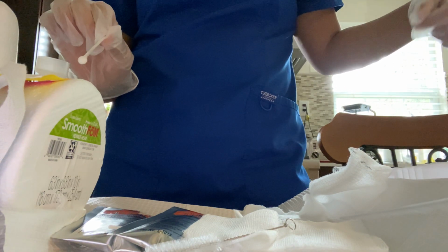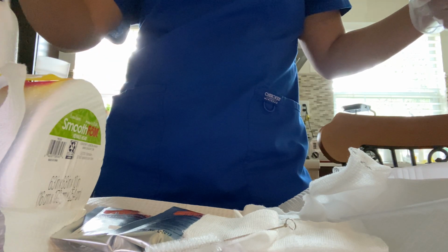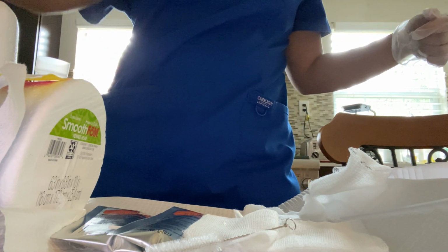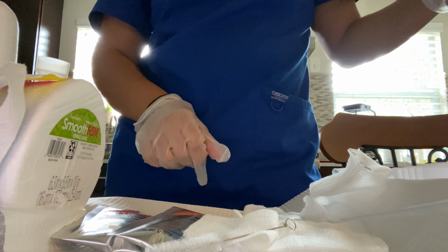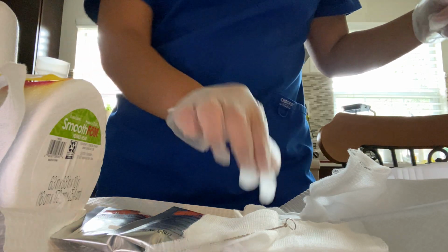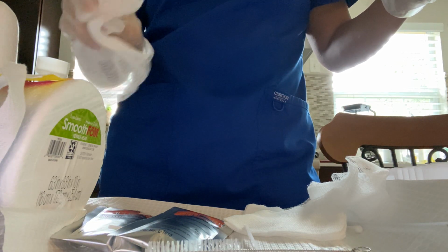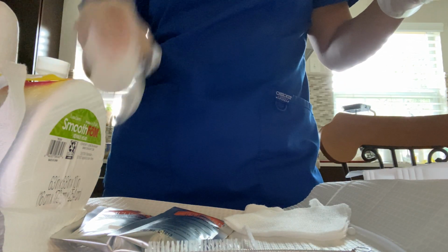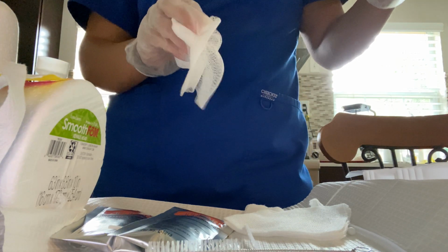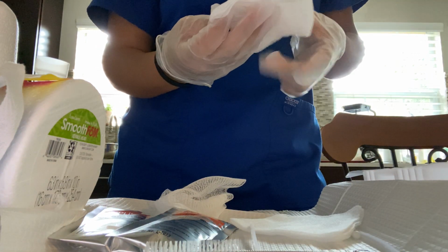And then we're just going to clean it. We're going to dip it into the clean saline. Like I said, clean inner to outer, and then toss it. And then we are going to get the gauze and saline and clean the inner to outer. And then toss it and then dry it. So you're just going to dry it, inner to outer. And then you just toss it and then you put your final dressing on.